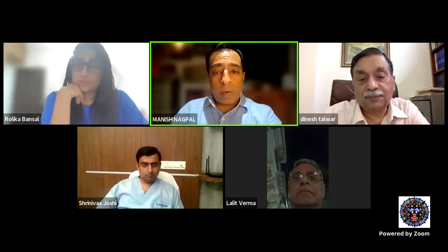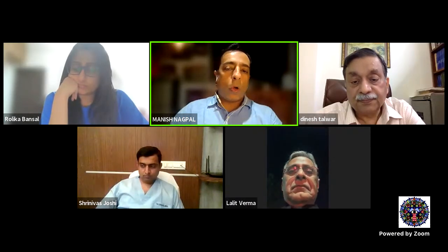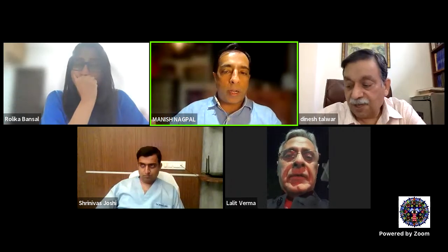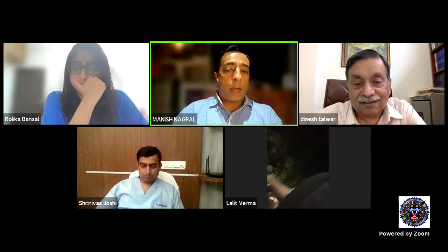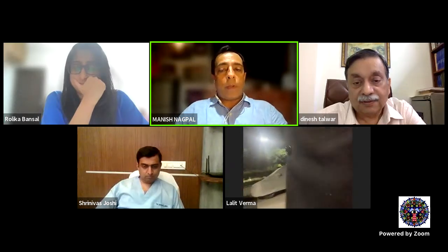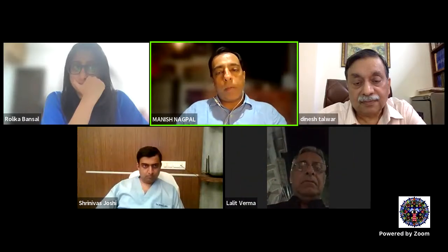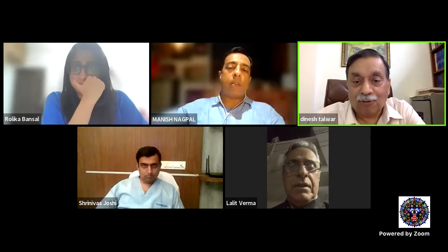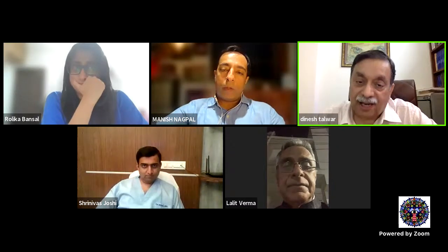Go. And the other point I wanted to make is that when you do a retinectomy, make sure you go into 1 or 2 clock hours of relaxed retina as well. Don't just stop up to the tenting. Go 2 clock hours on both sides, because that's again a very crucial area which you feel on the table has settled, but it may give way post surgery. That was my next question to you. Yes, so you've answered that already. But you were very fond of mentioning that previously.